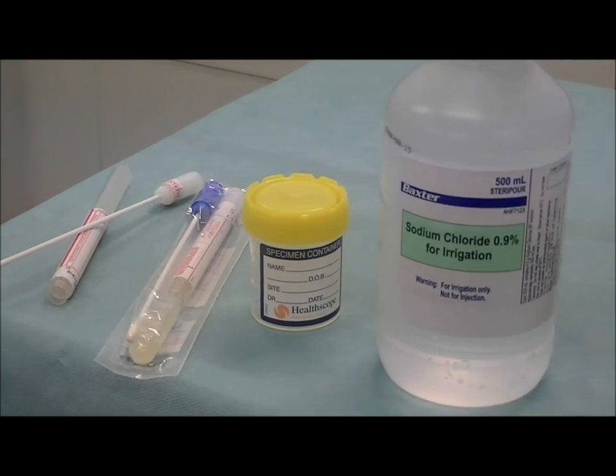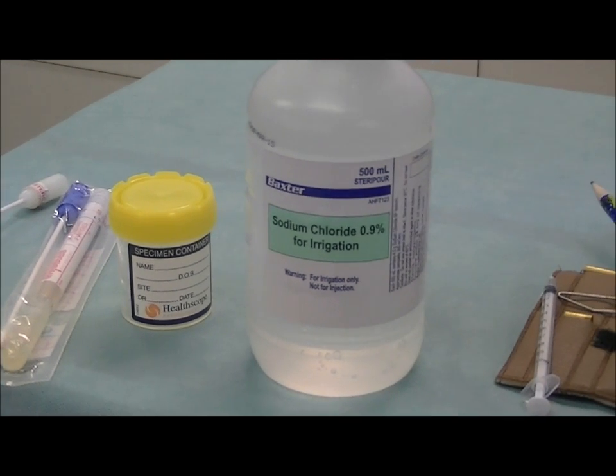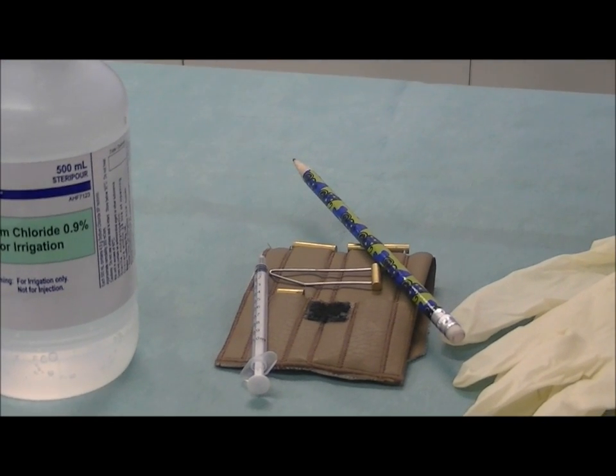The second thing you are going to need is a sterile specimen container — this yellow top container is an example of that. You are going to need two to five mils of sterile saline or sodium chloride — only two to five mils. You are going to need something to hold the snake's mouth open while you are taking the swabs. This can be a pencil, a small syringe such as a one mil syringe, or if you have access to it some proper snake mouth gags. A large paper clip would also be suitable.